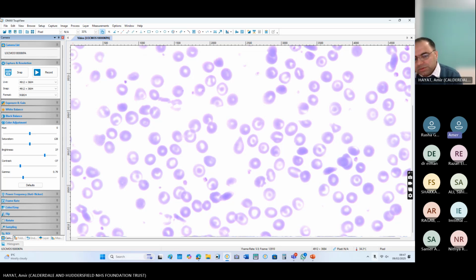When you report on the HPLC, you look at the abnormal hemoglobin, which is sickle cell here. What is A2? What is A naught? What is the F percentage? To compensate for high sickle hemoglobin, this patient would have some F as well. If it is all sickle hemoglobin, it becomes homozygous sickle cell.